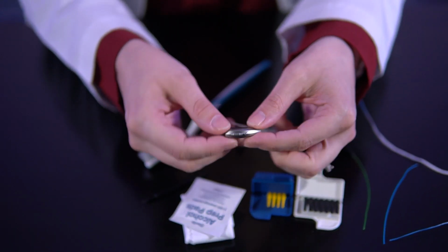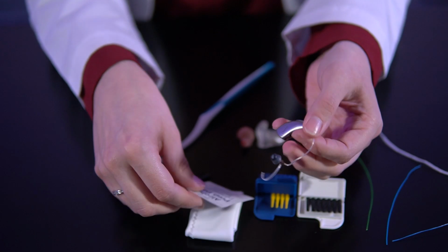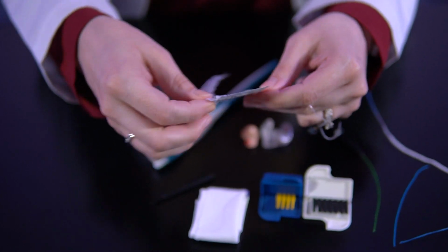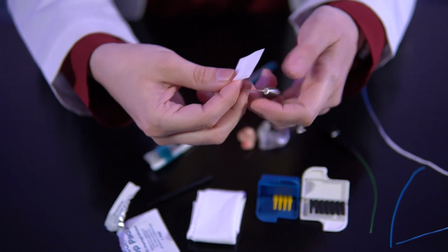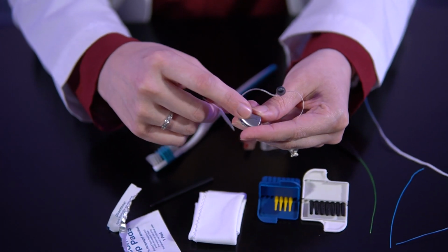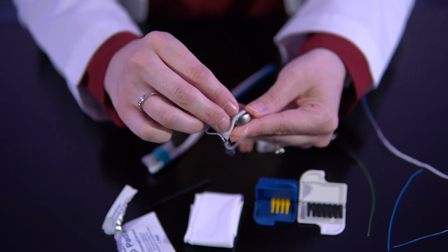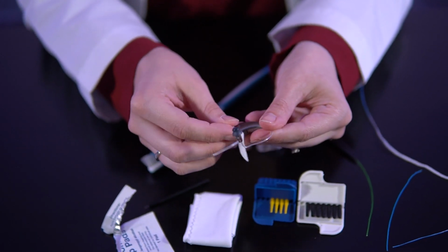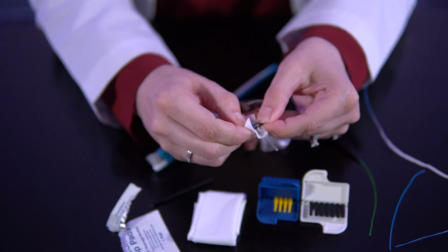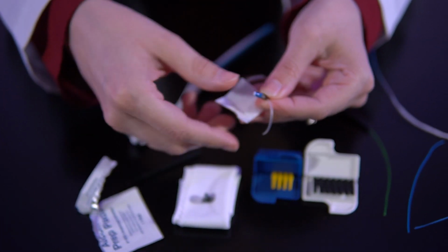So when we get this type of hearing aid here, one of the first things that I like to do is clean it off, okay? Ladies with hairspray, my best advice for you is to make sure when you're getting ready in the morning, hairspray first, and then let it dry and then put the hearing aid on, because this part of the hearing aid really gets skunked up with hairspray, okay? So you'll wanna wipe it down. We're just gonna kind of disinfect it. We're gonna wipe down our receiver line here and even our dome, and we'll pop it off at the same time too, okay? I'm gonna set that aside.